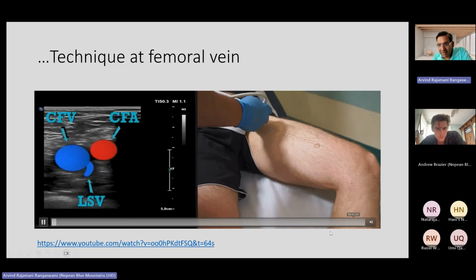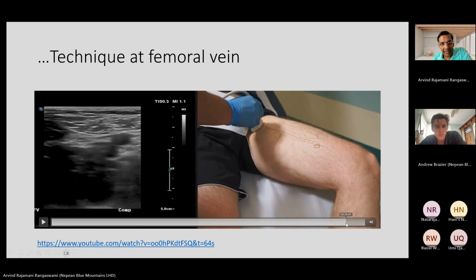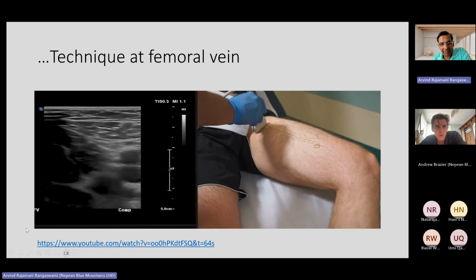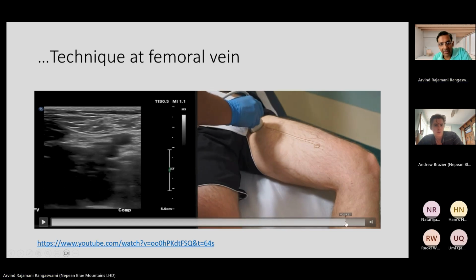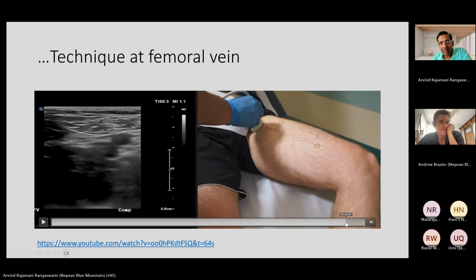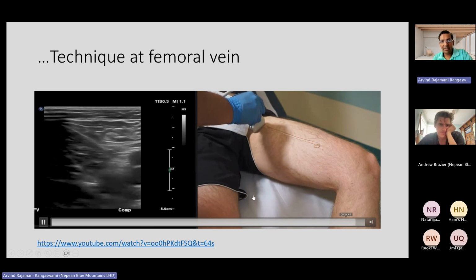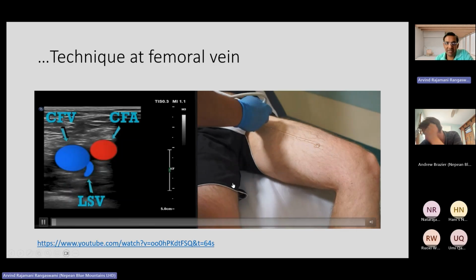But see this here, they have not actually taken the trouble. You still have a little bit of a gap, even though they see that gap there. That gap must not be there. You have to compress such that you have the entire thing compressing.